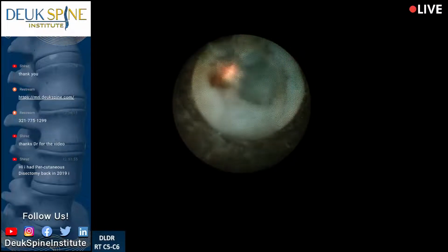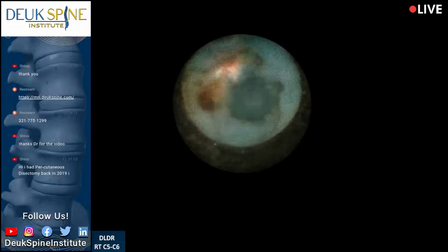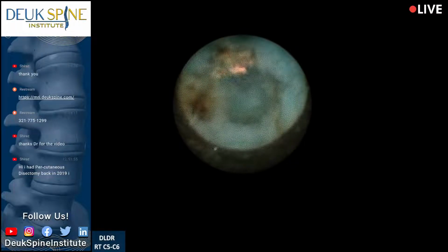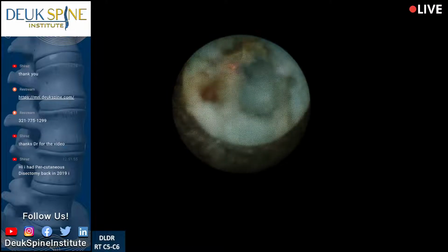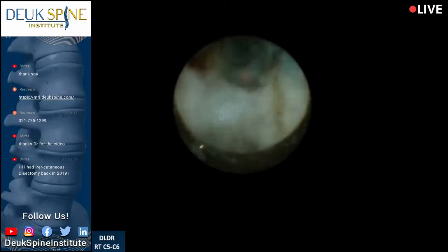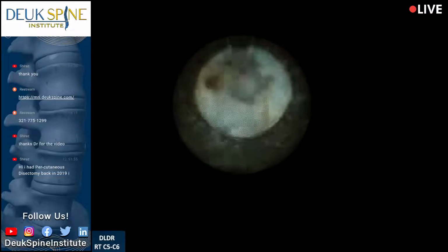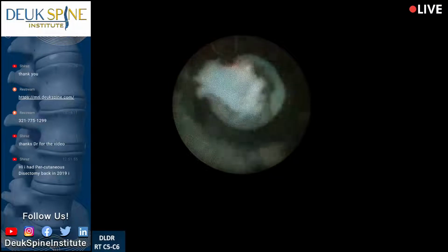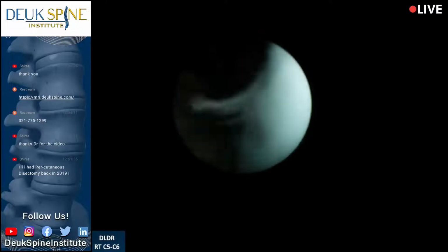But that's the nerve down there, just below these pieces. I'll show you in a second. The nerve is going to be down here, just there. And all this smashed stuff, these fragments are all just sitting there right on top of that nerve in the foramen.